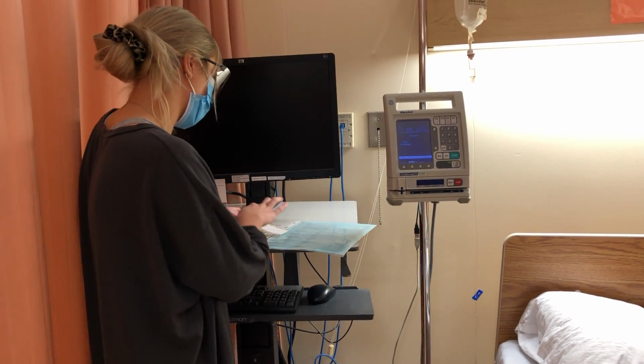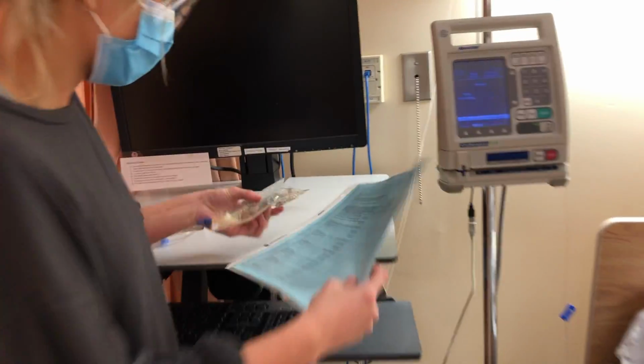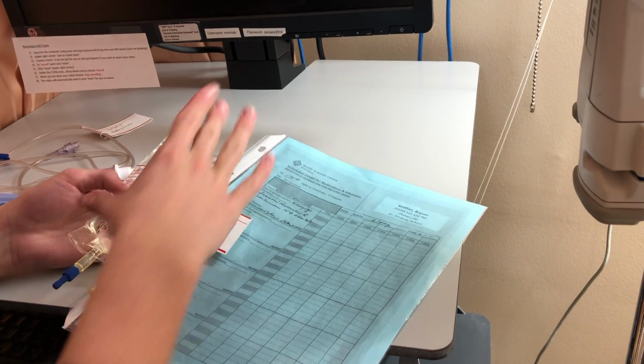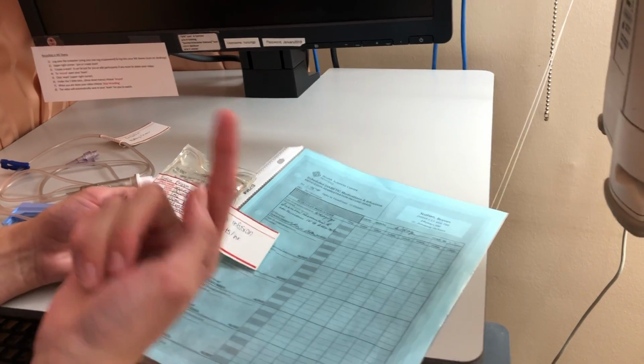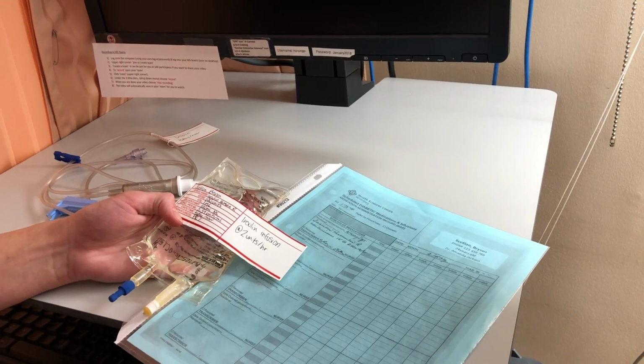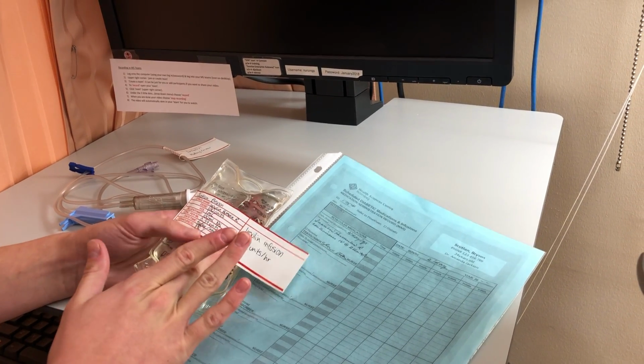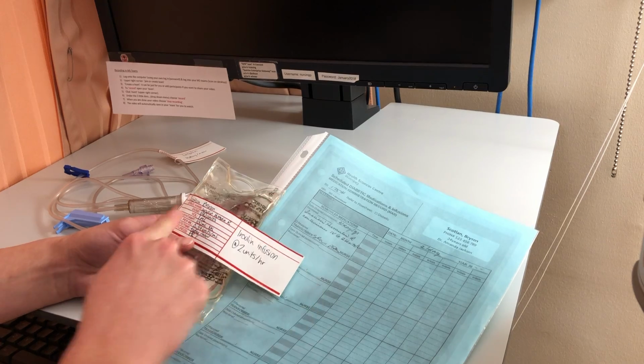So we've done our name. We have insulin Humulin R. Our dose is 100 units total in this bag that we injected of the 1 ml into this 100 ml normal saline. We have 101 ml total now, and a final concentration of 0.99 units per ml that will be running at 2 units per hour. It's been ordered for today and now.